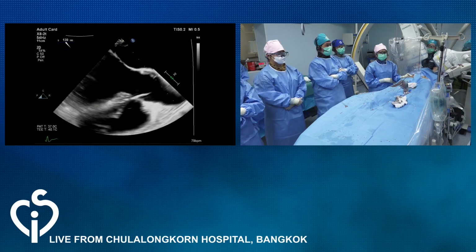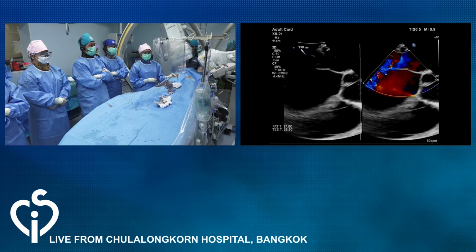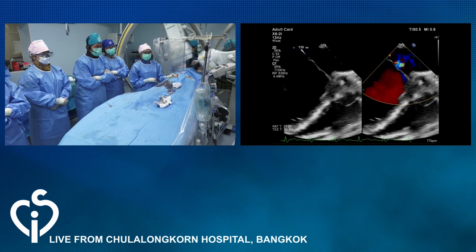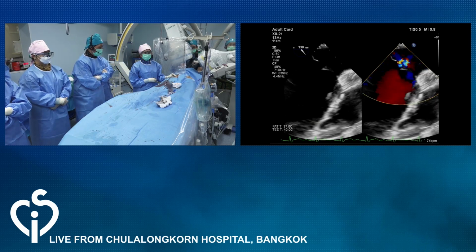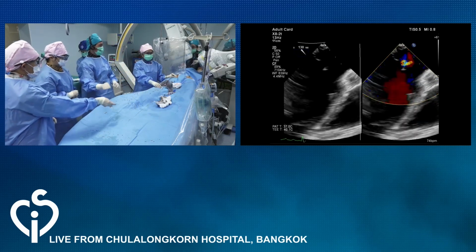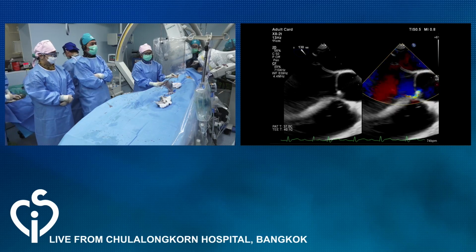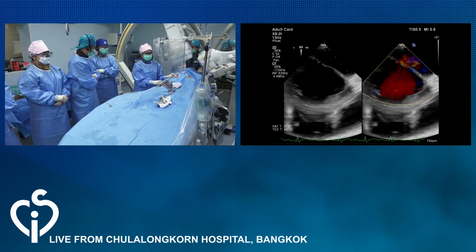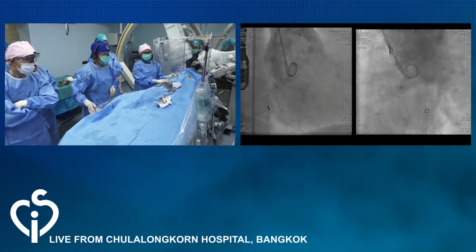But about the hemolysis, I think it's possible, but we need to do nothing, just observe and be conservative, because finally it will have no leak and the hemolysis will subside at that time. Thank you. Can they measure the constriction portion? Can you measure the waist on the device on fluoro? The reason I'm asking is the sheath was not going so smoothly.